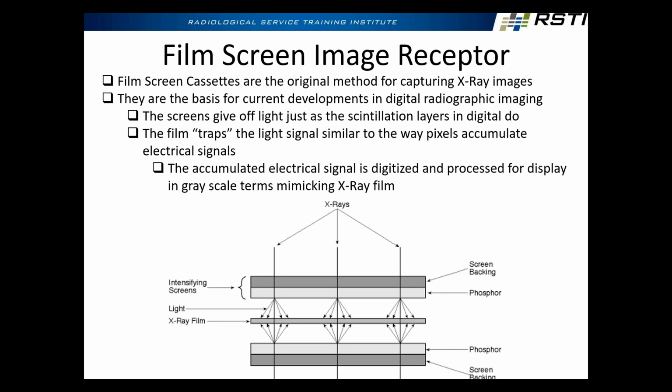The intensifying screens are phosphorescent screens that really all they're doing is providing more opportunities for interaction, right? When we expose film to X-rays, this is just a further building of our lack of efficiency in this system. We put all this energy into the X-ray tube, less than 1% of it comes out as X-rays. Of that, less than 5% would actually interact with the film emulsion. So they invented intensifying screens, these phosphor screens, to provide more opportunities for interaction. An X-ray photon that didn't interact with the film might interact with the phosphor, which would generate some light that would help to expose the film. Now, this same process of more opportunities for interaction is how some of our digital receptors work.